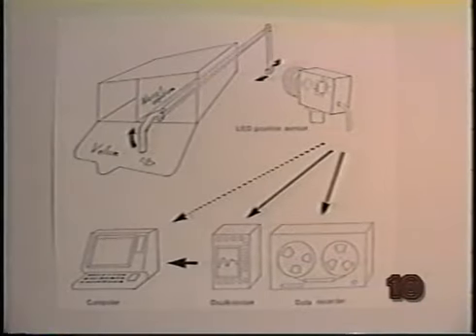Movements of the external lever can be monitored in several different ways. For example, one might use a velocity displacement transducer that would make the velotrace a convenient standalone device for the clinical evaluation of velar movement. This diagram shows another approach: optoelectronic tracking. In the system we've been using, a light-emitting diode, or LED, is attached to the end of the external lever to allow us to monitor the movement of the lever about its fulcrum.